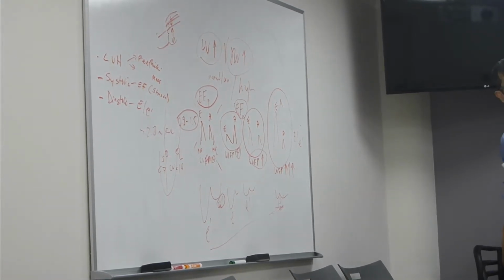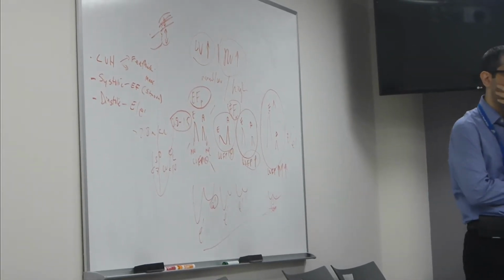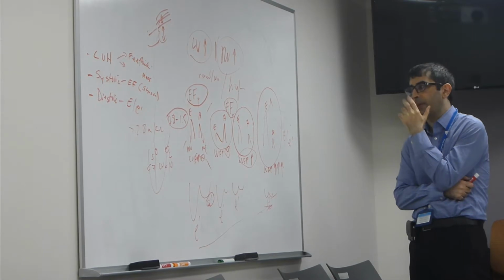So in isolation, just using the mitral velocity is probably not sufficient. Adding a tissue Doppler gives you a better sense of it. Right, exactly.